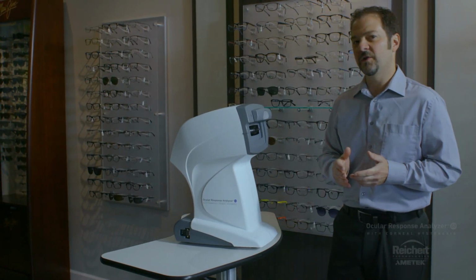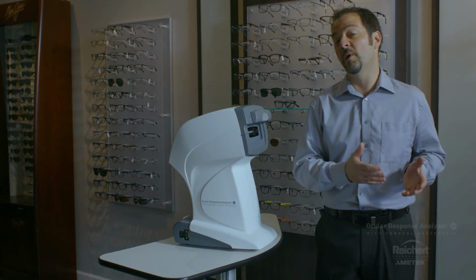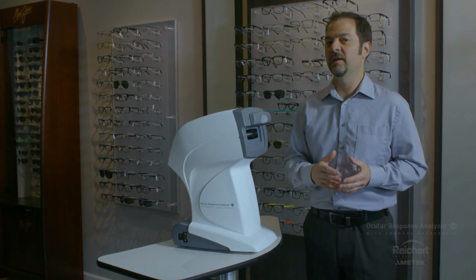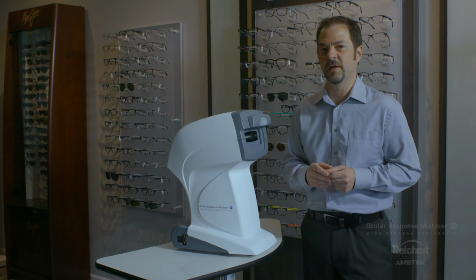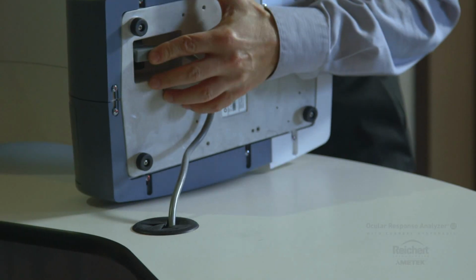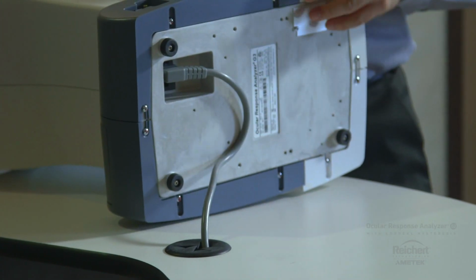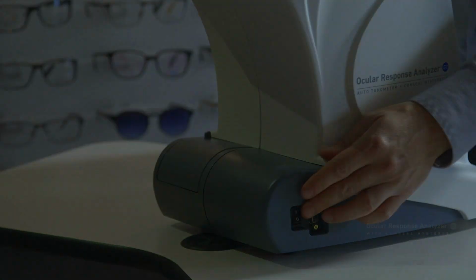You also want to make sure that you don't put the instrument in front of any bright sources of light, such as an open window, or any other instruments in your practice that may generate infrared light, as infrared is used in the measurement process of the Ocular Response Analyzer. To power the instrument, you simply plug the cord into the receptacle on the underside of the instrument, and then you can route the cord anywhere you'd like to. And there's a power switch right here on the side of the device.